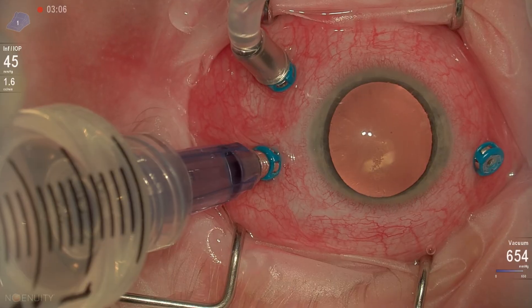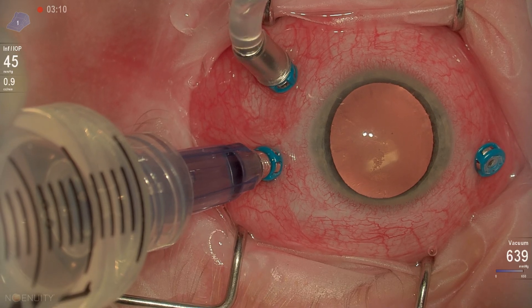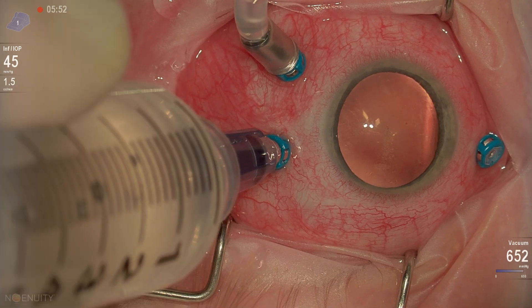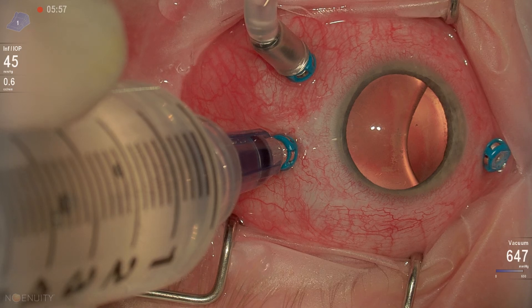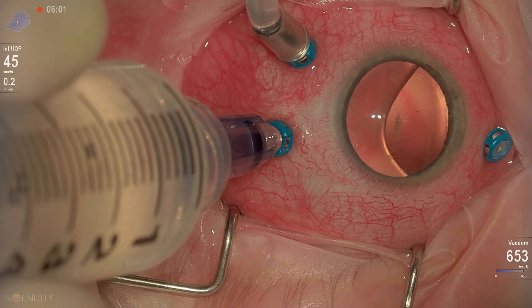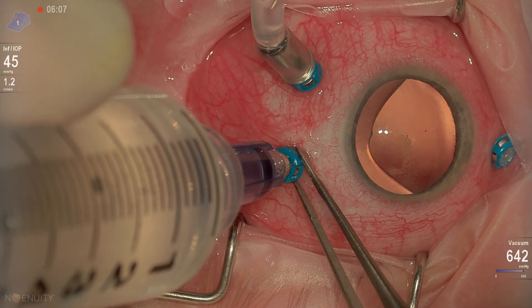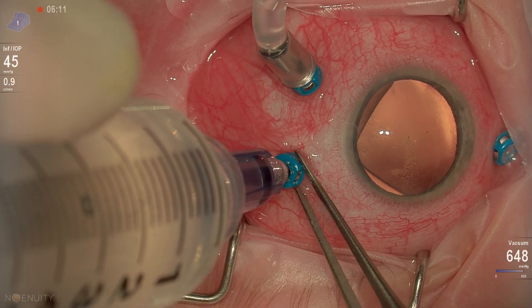A couple pearls for removing silicone oil. First of all, you want to make sure and have in your visualization not only the pupil with the red reflex, but also your oil extrusion cannula. You can see here, I can actually see the oil kind of bubbling up into my VFC cannula. And then in the red reflex, we can actually see once we've removed the majority of the oil, as we're starting to get towards the end of things, we can see that oil crescent kind of move by nice and slowly.